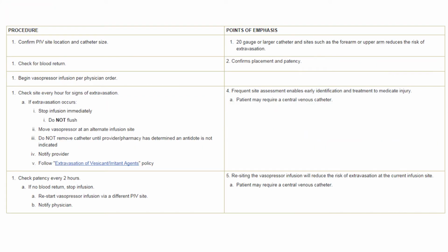The assessment and documentation for vasopressor use via a peripheral IV must include an IV site assessment every hour and checking for blood return every 2 hours.